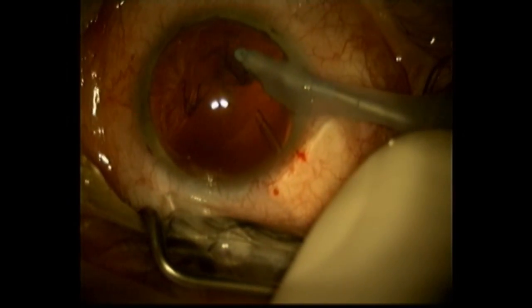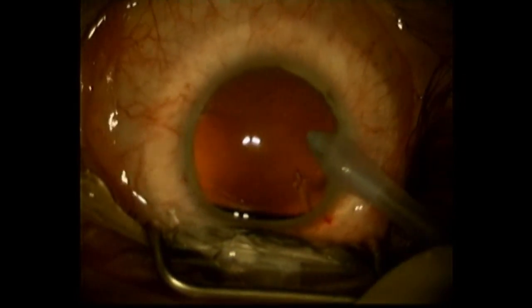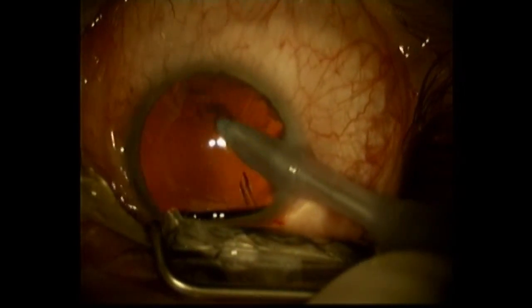You'll see the residual cortex removal here. Shortly, I'll be inserting an intraocular lens into the capsular bag.